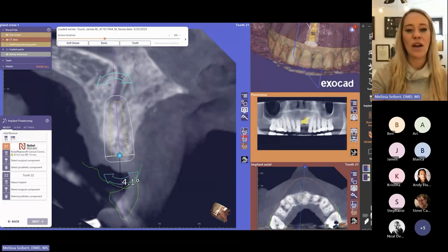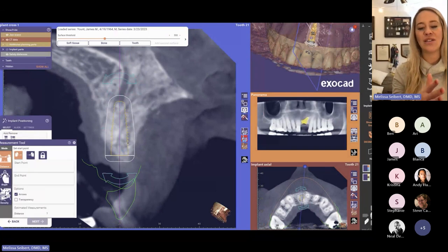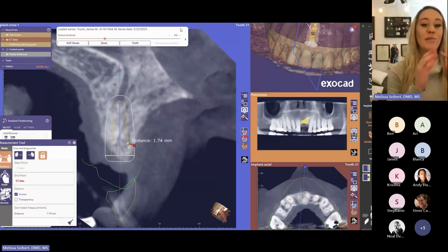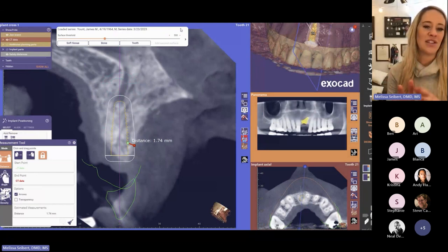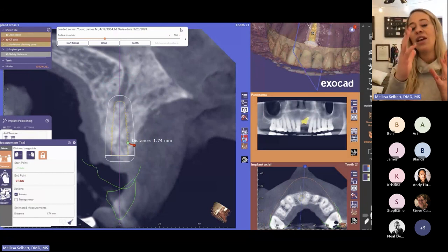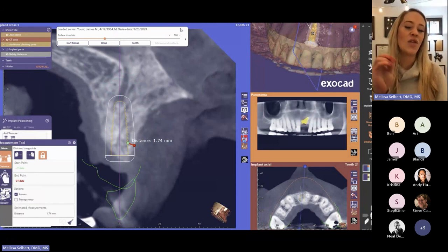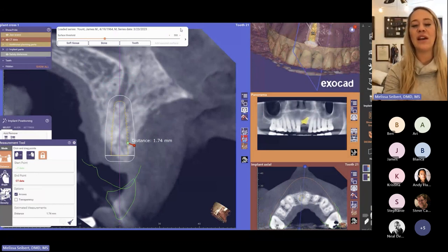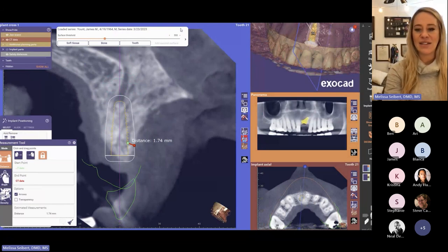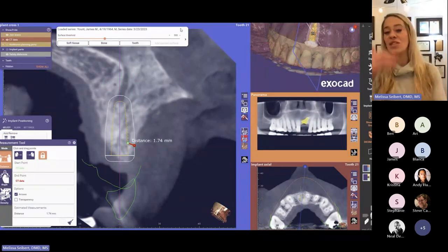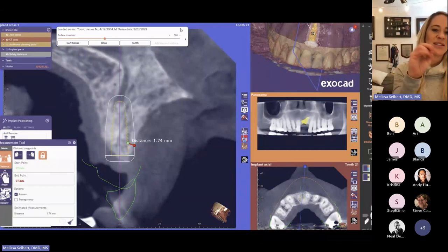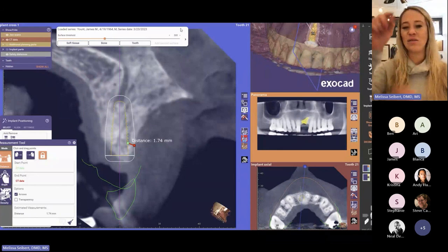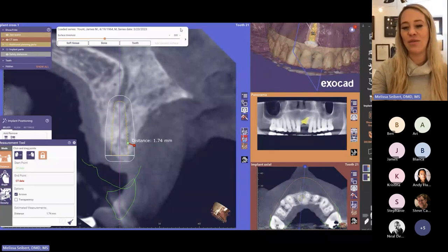Here's another feature I kind of stumbled on by accident — you can actually use the arrows to adjust the implant. I can select a longer option or a wider option. With previous softwares, we would have to replace the implant entirely when making dimensional adjustments. I can also use the measurement feature to measure the distance from the implant to the adjacent bone. I was toggling, trying to make the decision between cement-retained and screw-retained. Generally, I like to make my implants screw-retained — not necessarily because of excess cement concerns, but more so for retrievability when possible.